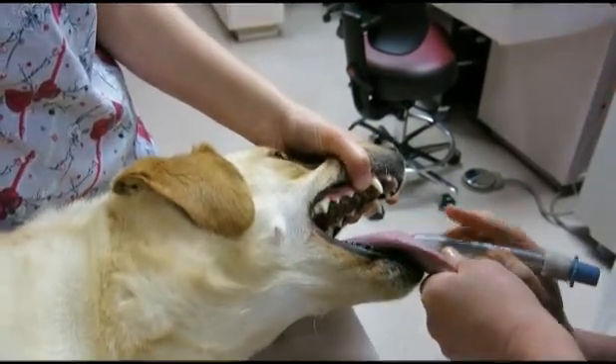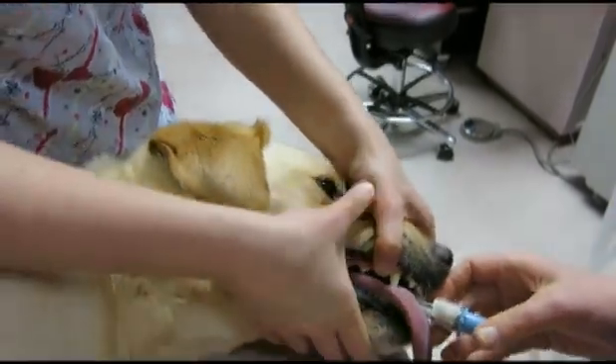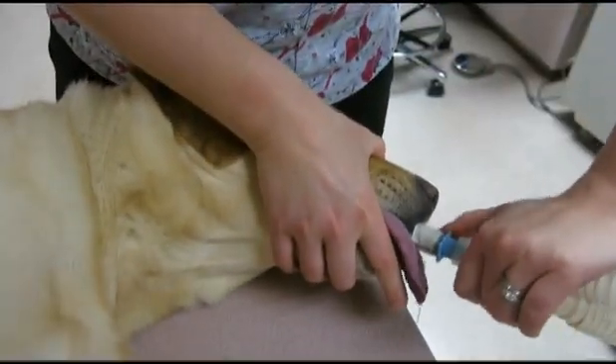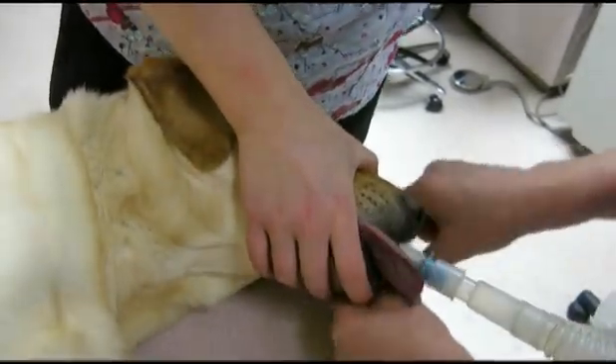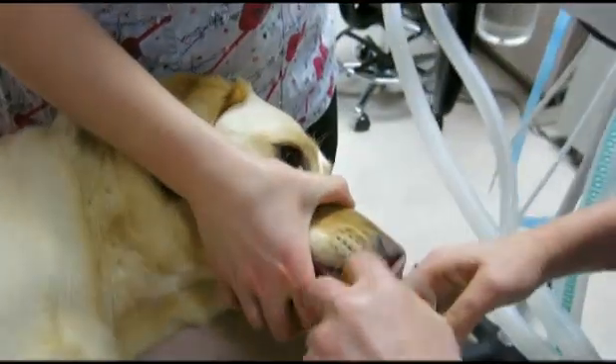Here I am putting the endotracheal tube into my patient's trachea, and that little cough means it's in. Then we connect the endotube to the anaesthetic machine through this tubing. Now I must tie the endotracheal tube in place so it doesn't slip out during the anaesthetic episode.